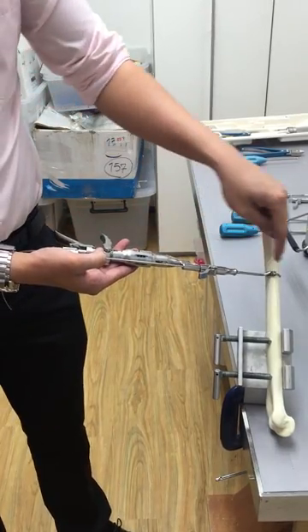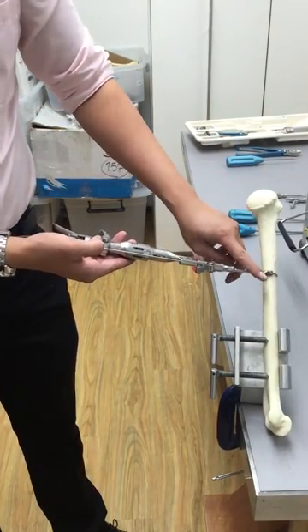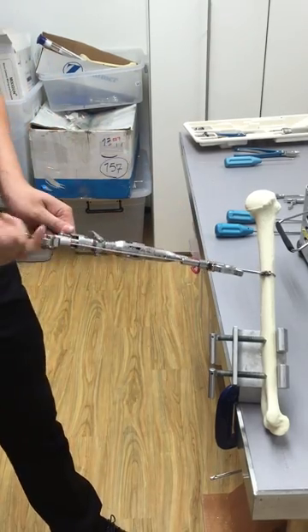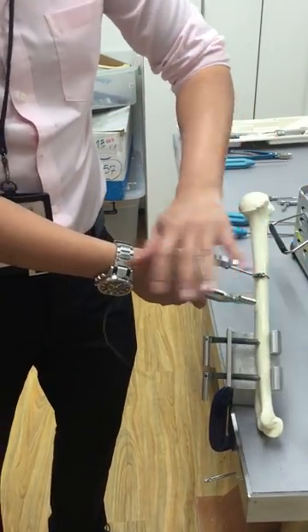If you're going to put in the cable at the next position along the shaft and still want to maintain the tension here, all you need to do is lock this part, unlock the top part, take this out, leave it in there, and then do the next cable. That's all.